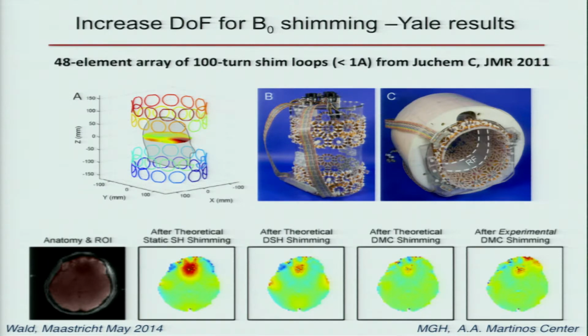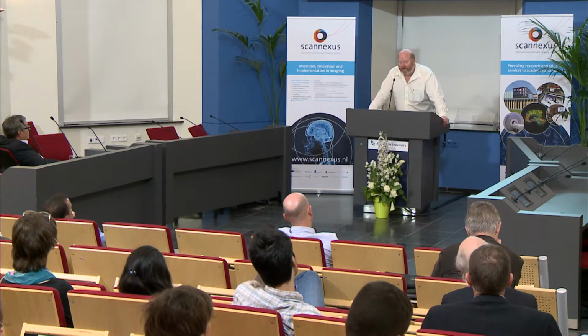Now, what we think we really need to improve is the encoding. You think encoding in MR is done by the gradients. Well, that's actually kind of wrong, because the RF channels actually do more encoding when you're doing a factor of 9, 12, 16 encoding. Say you're doing multi-slice, multiband 8 with 2 in plane, that's a factor of 16. So for every gradient encode line, you're generating 16 with the RF coil.